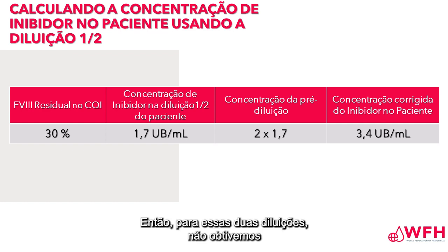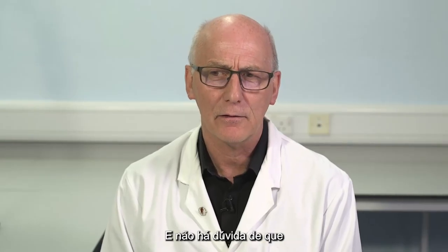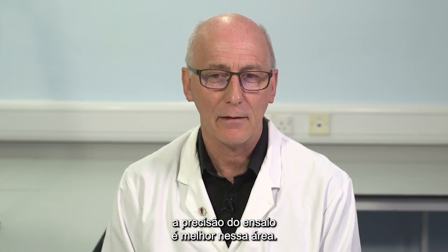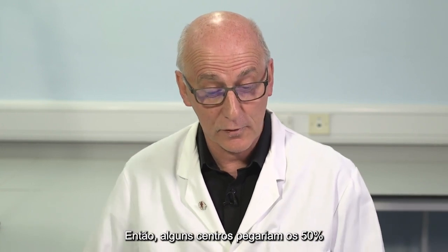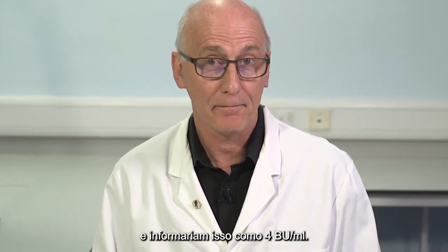So for those two dilutions, we have not obtained identical answers, 3.4, 4.0. And in my experience, that kind of variability is rather typical of the assay. I think there are two approaches. Some centres will say, I will take the dilution in which the residual is closest to 50. There's no doubt the accuracy of the assay is better in that area. So some centres would take the 50% and report this as 4 Bethesda units per mil.